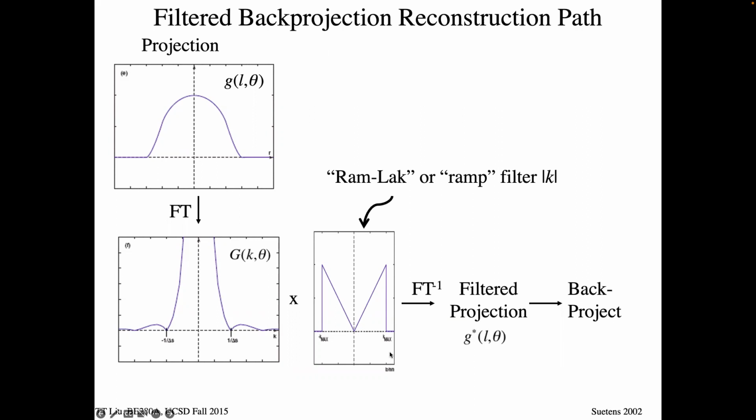Does that mean the absolute value of K, or is that just the way to represent those functions? Yeah, it's the absolute value of K. The function we're using in the two-dimensional space will be 0 at the origin, and it will go up linearly in any direction from the origin. So it truly is the absolute value of K, which is the distance from the origin, and it gives you a circle all at the same height around the origin.